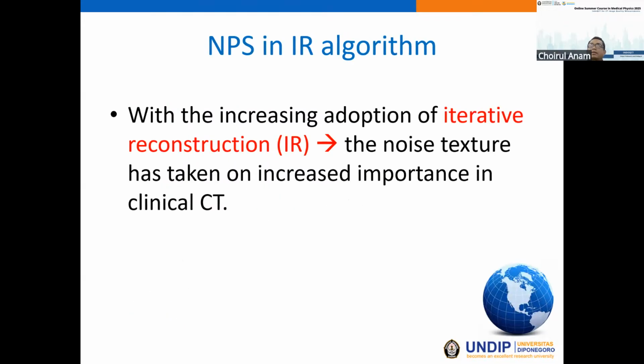In the standard image reconstruction, filtered back projection, the frequency in every noise is similar, but in the iterative reconstruction, especially in the deep learning reconstruction, the noise structure has taken an increased importance in the clinical CT.